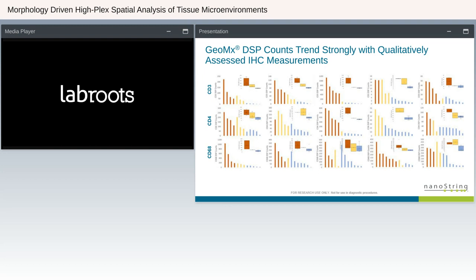And in some instances, you could see maybe where a pathologist's eye would have a really hard time differentiating between the high, medium, and low. With the genomic system, we're seeing all of the heterogeneity even within those categories. And so just giving you some advancement over what's been done historically over almost a century now of pathology work and really bringing it to the digital age.